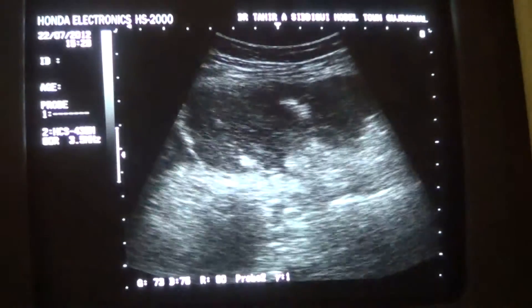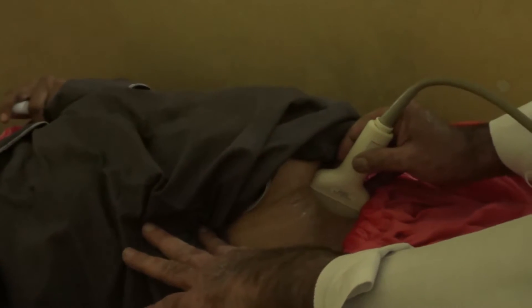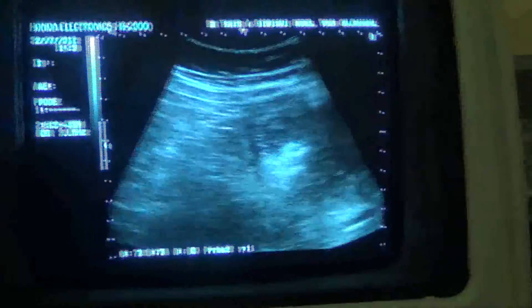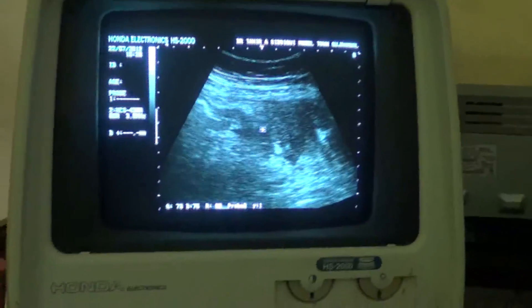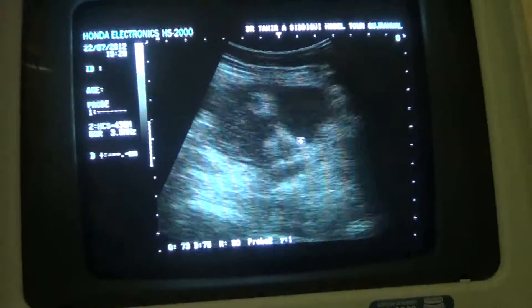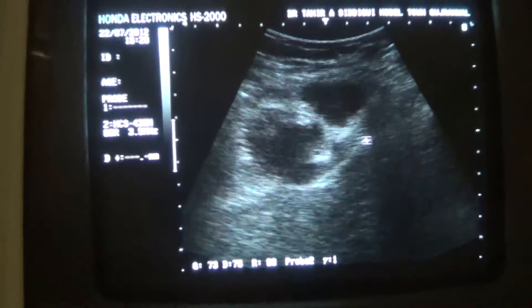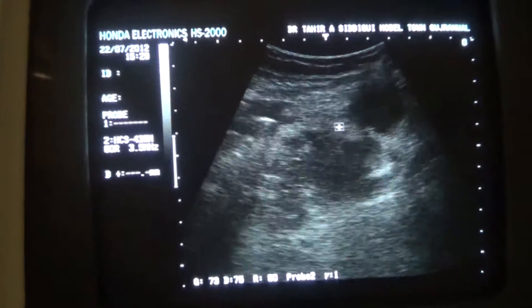See where I am scanning from — this angle. I started from here in the transverse section, then I moved the probe longitudinally, and then I went up in this section up to this area. This is the lower abdominal quadrant, and here I am coming down. This is the urinary bladder, and this is the abscess or collection — pelvic collection.